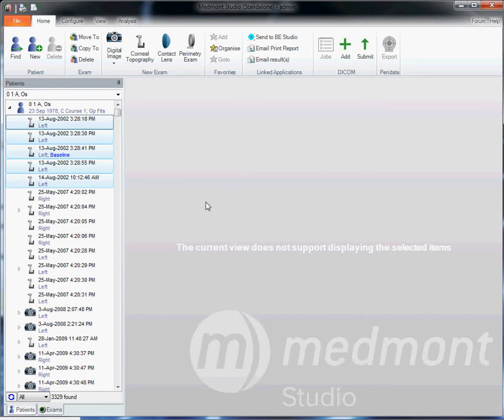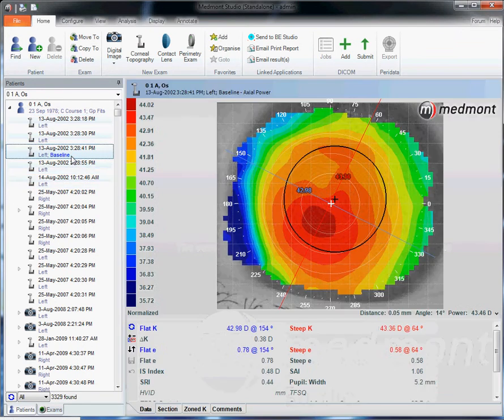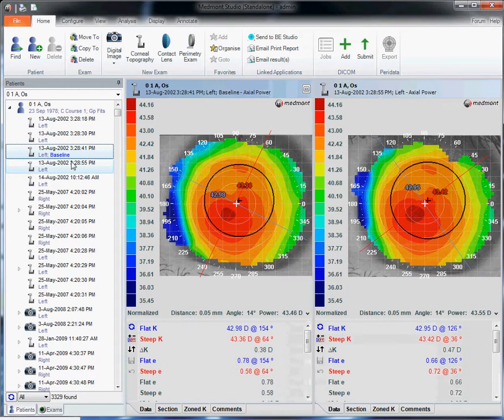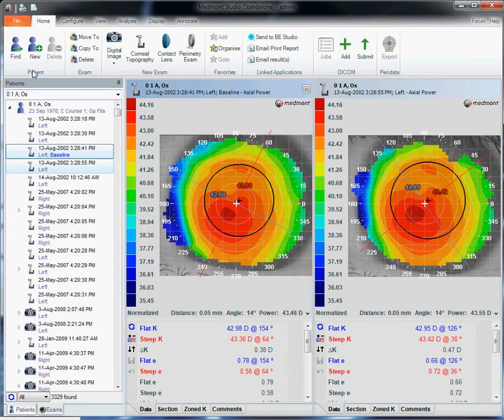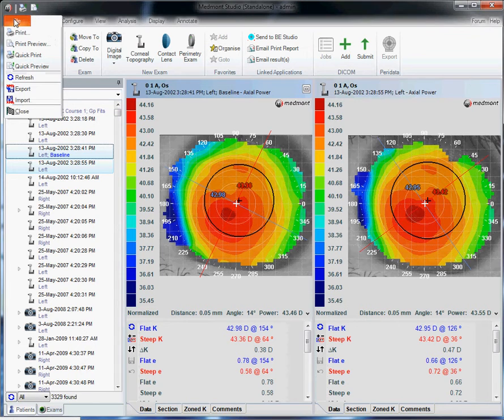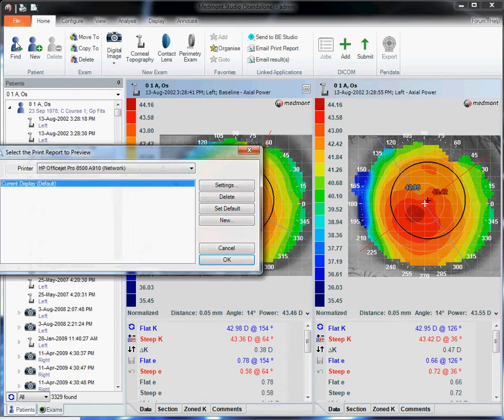If, however, you're sending the topographies to somebody without the Medmont software, such as a patient, you could highlight the maps you want to send. Up to 4. Then go up to file and print preview.